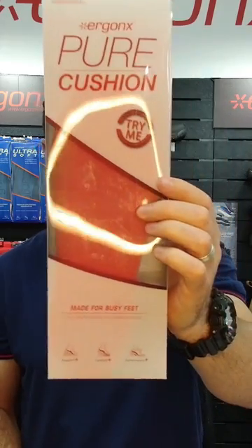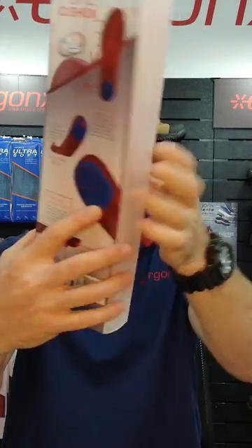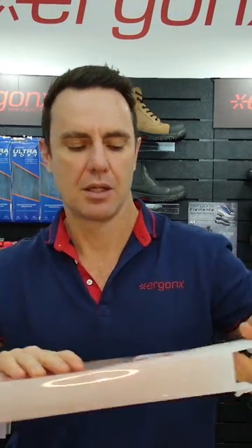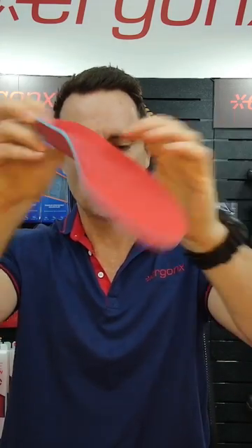The Ergonix Pure Cushion Orthotic Insole. This is a low arch support, highly cushioned orthotic insole.